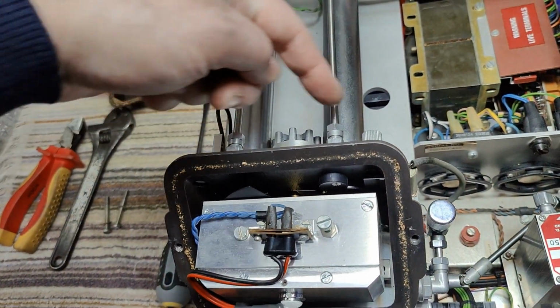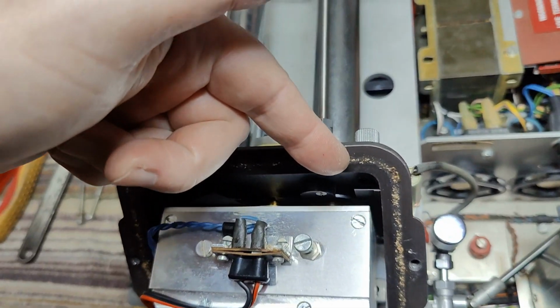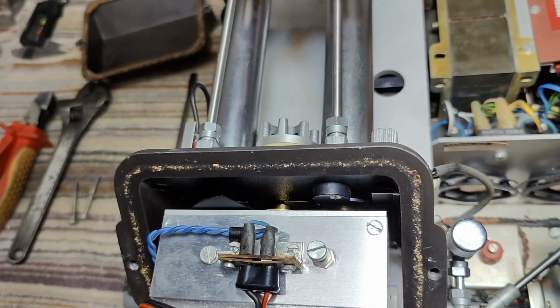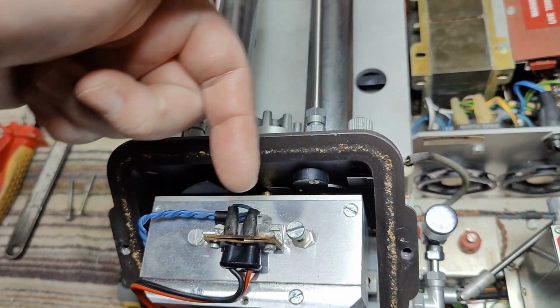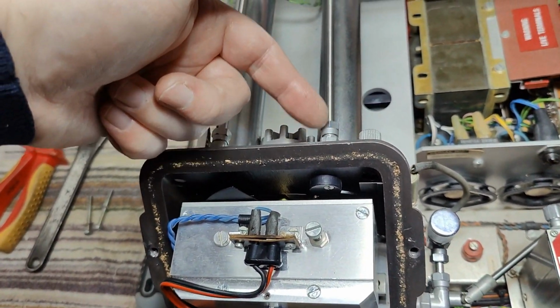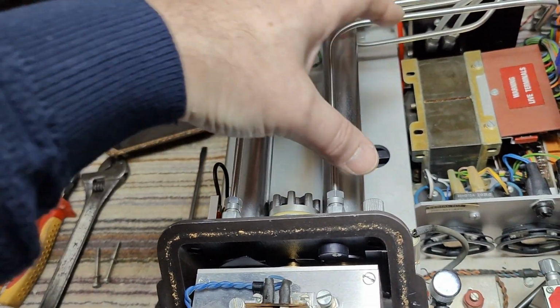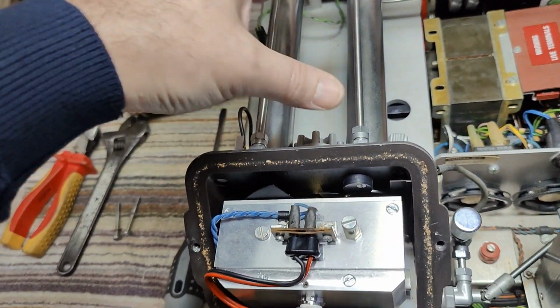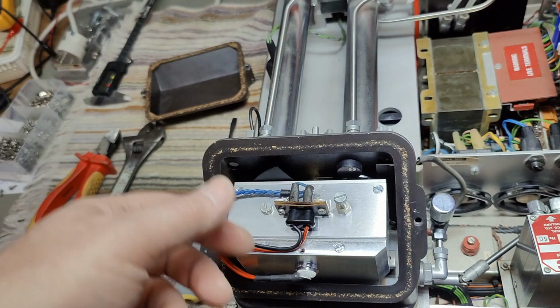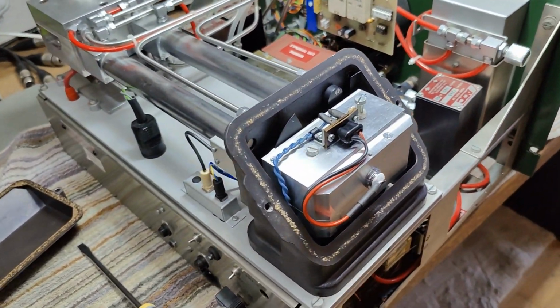And you got different samples in these two. So there's probably a little glass or something down here in one of the ends that will allow light to go through, but not the gas. Obviously, you want to stick it into the sample, so it's pumped through this, and the other sample is here. So you have the A-B type of sample. So it's an optical detector. So far, so good. Now we know a little bit more.